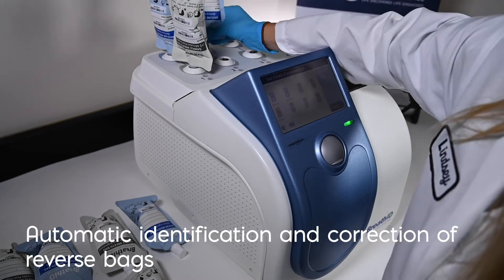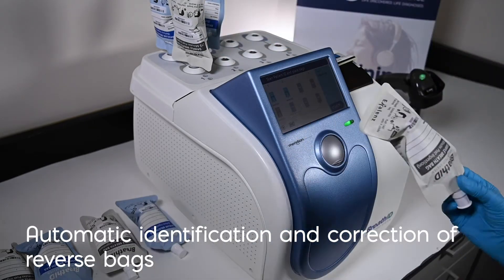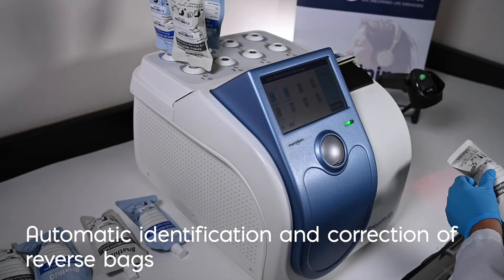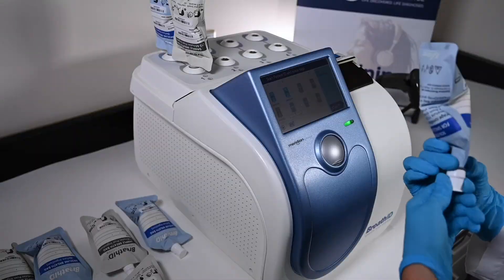The BreathID Smart provides automatic identification and correction of reversed bags and will alert the user if they scan a wrong or mismatched bag. This feature reduces errors and invalid results while giving your laboratory peace of mind by ensuring the results are being reported correctly.